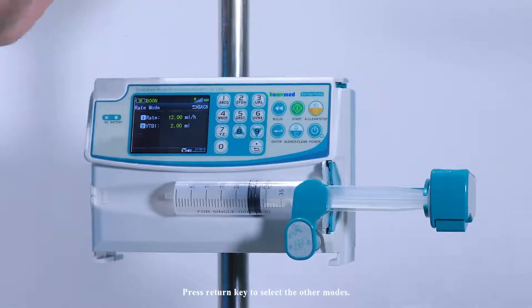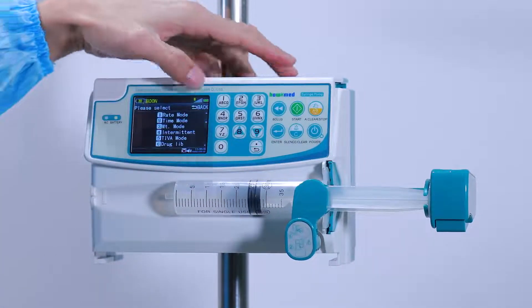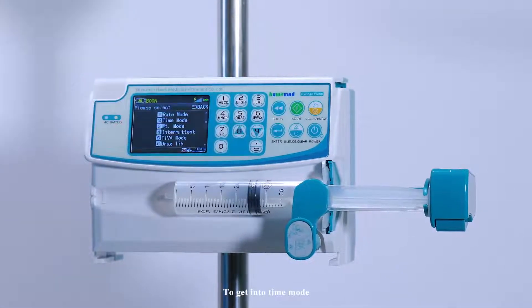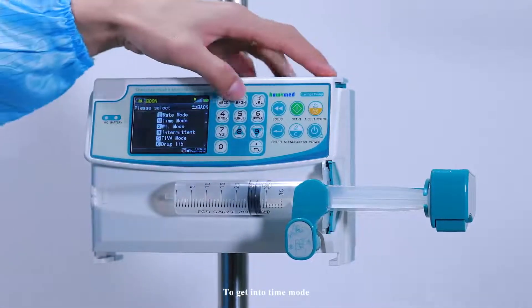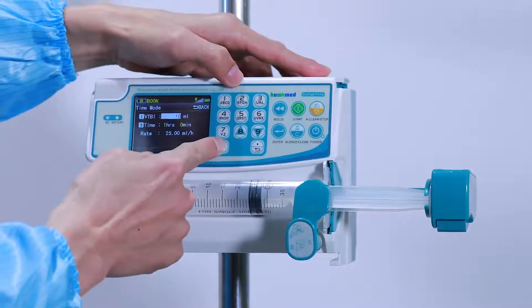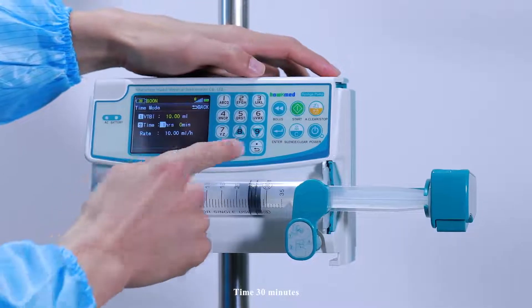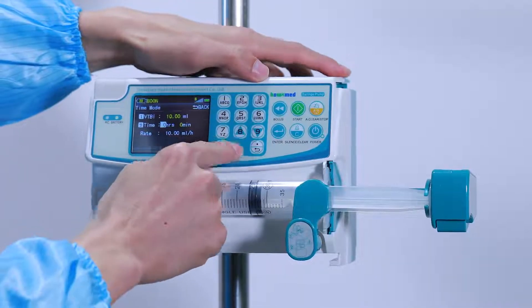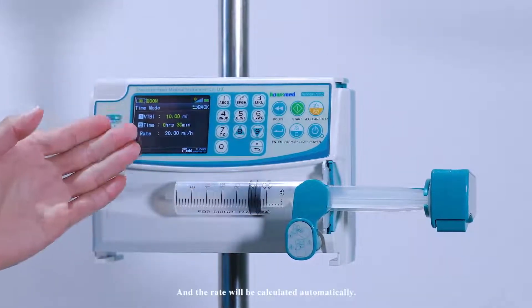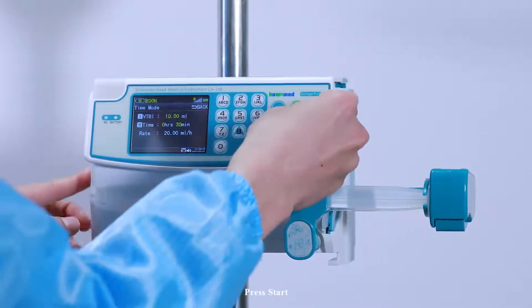Press return key to select other modes. To get into time mode, press 2 and set VTBI to 10ml. Set time to 30 minutes. The rate will be calculated automatically. Press start.